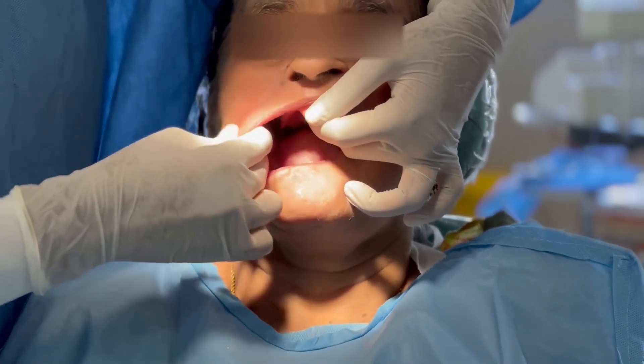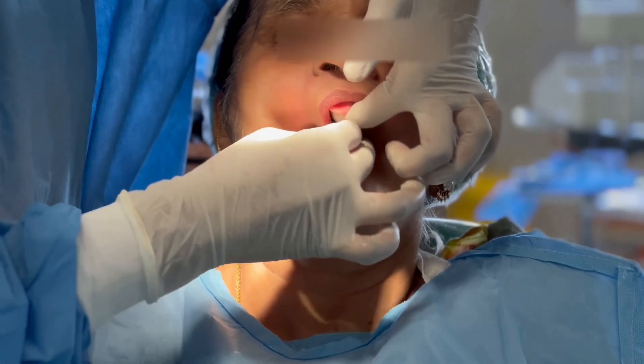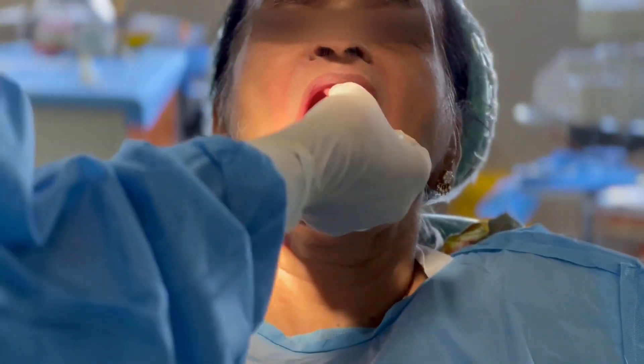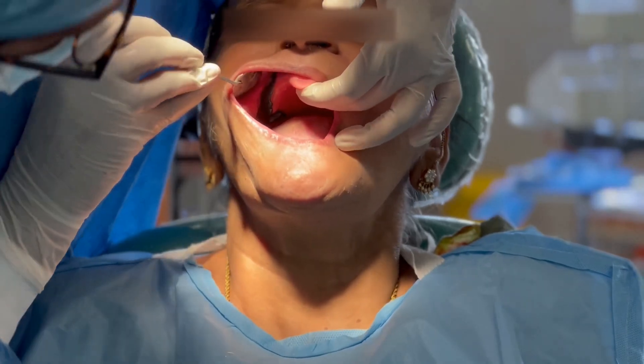For the distobuccal area, this should be performed bilaterally. Passive movements: the cheek is pulled outwards, downwards and inwards. Active movements: the patient is asked to open the mouth wide and close, and move the mandible from side to side.